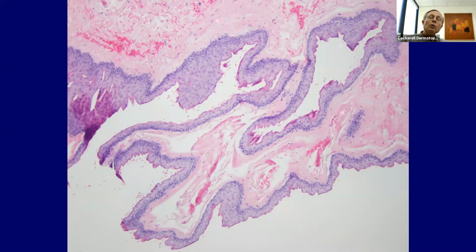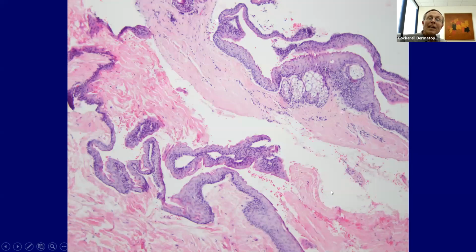But what if I just showed you this field? Would you call this Steatocystoma? I hope the answer would be yes. Because when you see this corrugated lining, it's almost like it's got keratin lining in it. It's an adherent single layer of compact cornified material that's thrown into folds, and it's basically corrugated like this. That's classic for Steatocystoma. You can call it shark tooth.